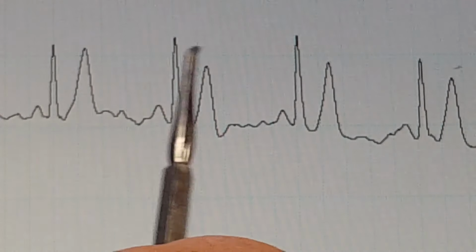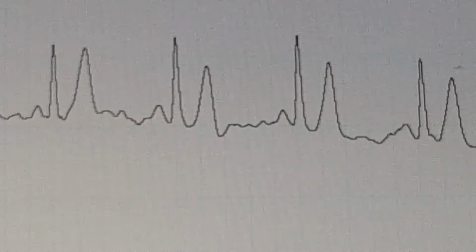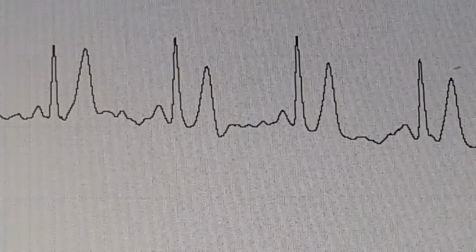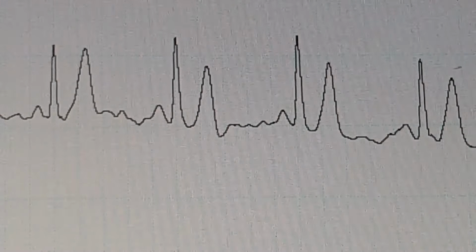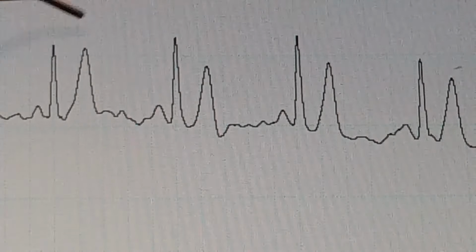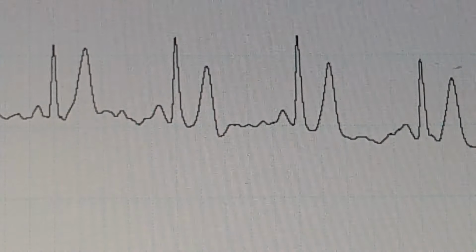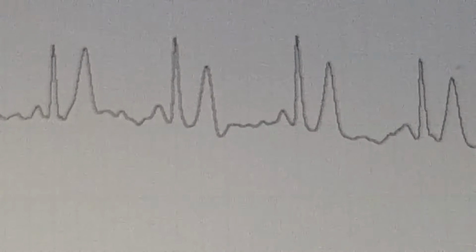P, QRS, T. When people count these things, typically what they are counting is the QRS spikes because they're very easy to identify. Now I mentioned before this is a passive electrical recording of what my heart was doing. The P wave right here represents atrial depolarization. And you have to say it that way. Atrial depolarization. The QRS here and here represents the depolarization of the ventricles. And the T wave represents the repolarization of the ventricles.